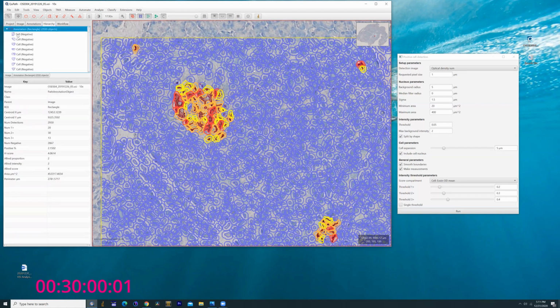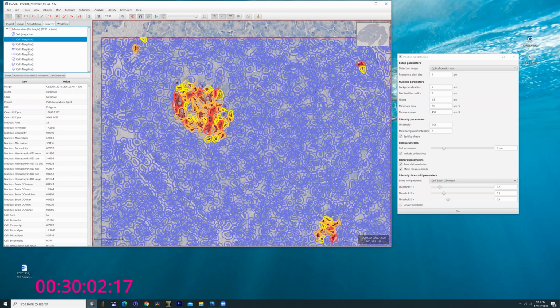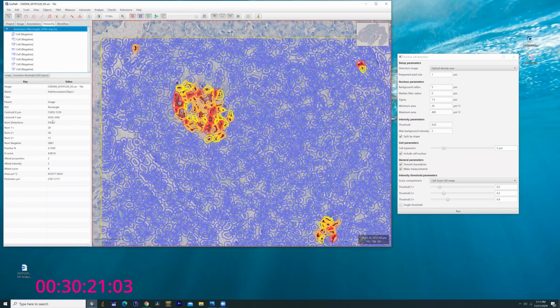Within the annotation tab, you actually have a representative image or scale, drawing of the cell and its count, so you can identify every cell that's counted. Each one of these is actually linked to an individual Excel row buried within the data set. But for right now, you just get the idea that this is basically all of your count area. This is a summary here. The yellow is represented by the number 1, the orange by number 2, and number 3 is your red.